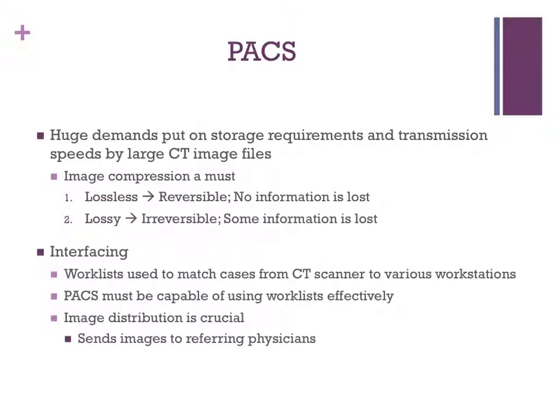So then there is interfacing with the PACS and the CT. The work lists are used to match cases from the CT scanner to various workstations. So a PACS must be capable of creating and using the work lists effectively. Image distribution is also absolutely crucial regarding PACS, since it must have the ability to send images to referring physicians.